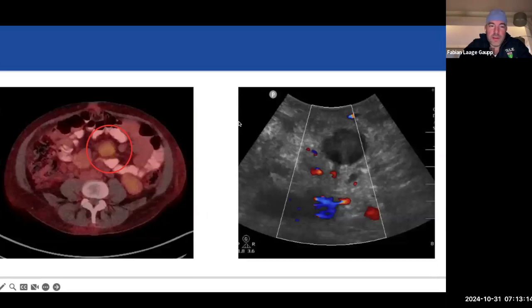And then we talked about this somewhat tricky biopsy when you have a lesion that's more central in the abdomen, and different techniques for how you can get there without going through bowel loops. So we talked about displacement. Sometimes you can just push the ultrasound probe down firmly, and with that displaced bowel, as you can see here. Sometimes you can also strap something on the patient to push things apart.